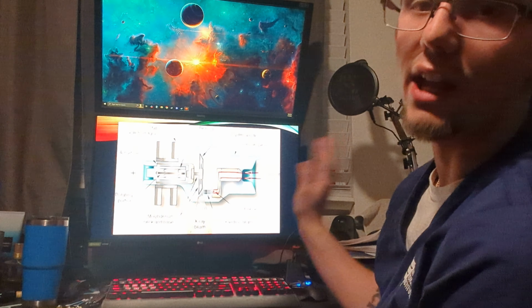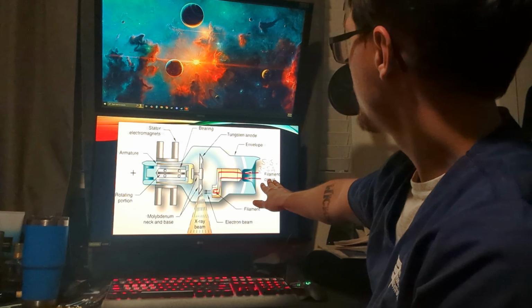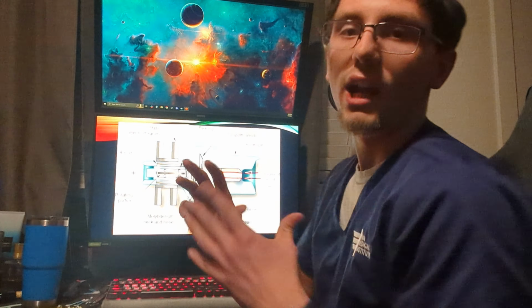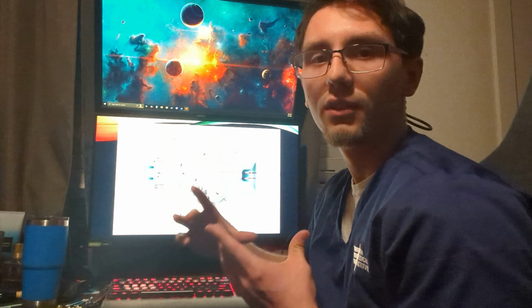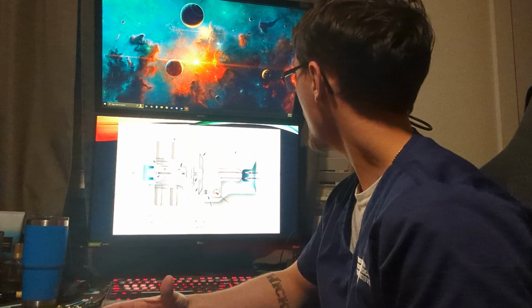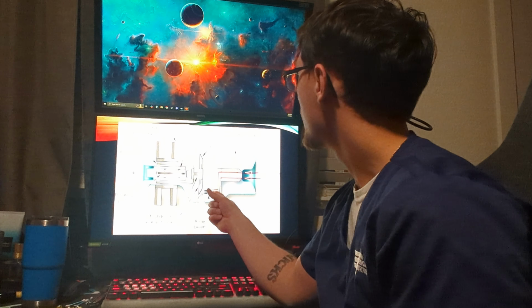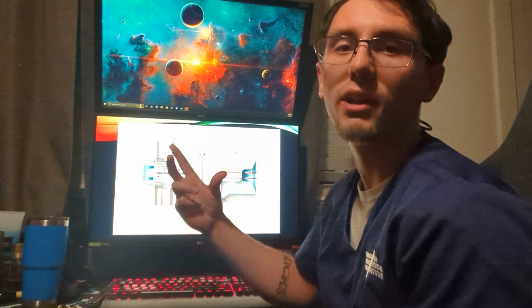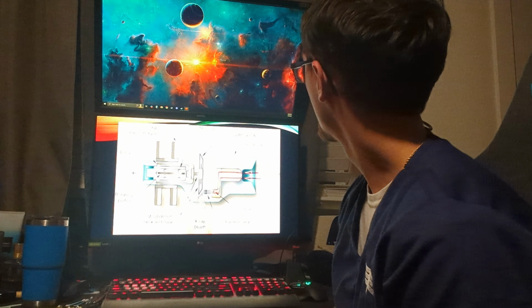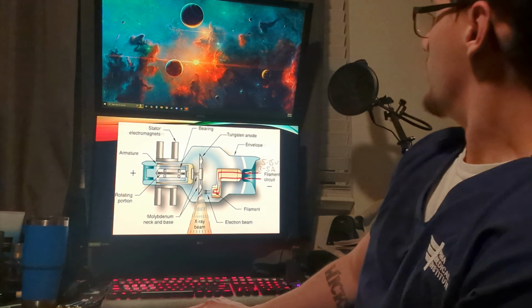Okay, so this is our actual X-ray tube. Before we talk about the actual filament circuit, I want to mention the envelope. So the envelope is a Pyrex glass or metal cylinder-like container that maintains the vacuum inside the X-ray tube. And a vacuum is necessary because if there's any air molecules, the electrons moving at extremely high speeds could collide with them, and it'll cause inefficiencies in the X-ray production.